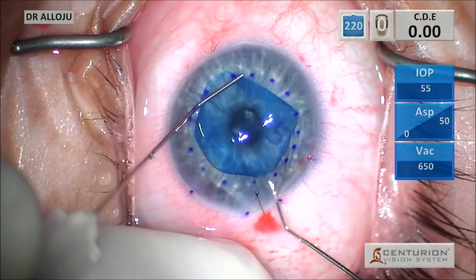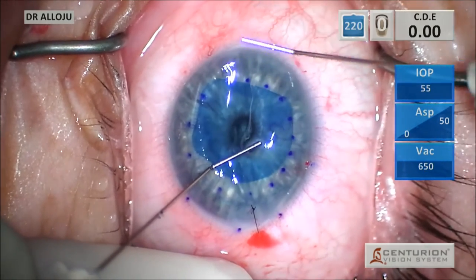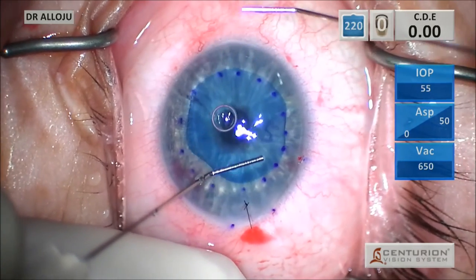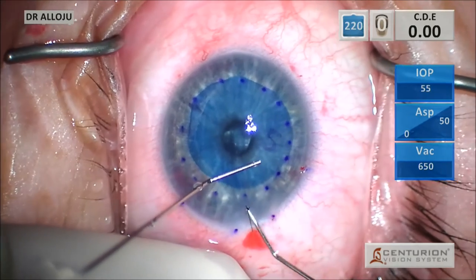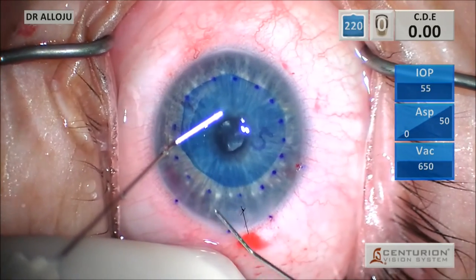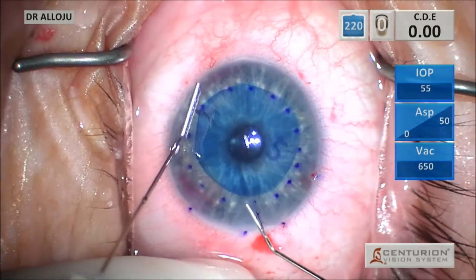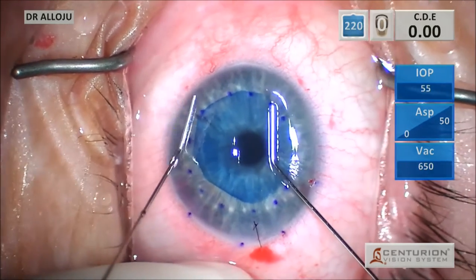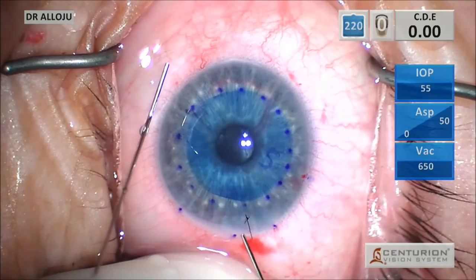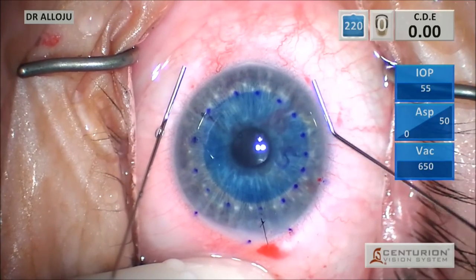Now it's a 55-year-old graft, so this graft tends to scroll more than an older graft. It's very important to try to get all those edges unfolded. They'll often end up just causing you more of a headache down the road. So keep shallowing the chamber and unfolding each of the edges until all of it's done. And here I'm pretty happy.